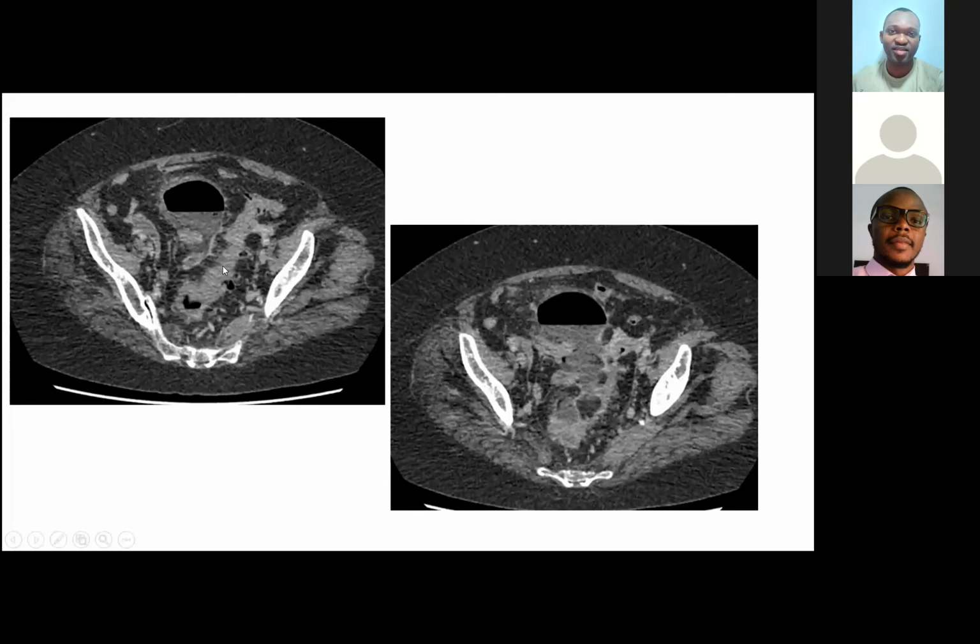So you've got to be careful that you don't put too much faith in what's reported as a normal X-ray of abdomen. There's a lot of pathology you can miss on an apparently normal X-ray, from inflammatory pathology such as abscesses and neoplastic tumors, to vascular ruptured aneurysms. All that can be missed on what is reported as a normal X-ray. And so if your patient is unwell and presented acutely, you've got to think seriously about performing the biggest hitter you have available. And in most instances, that means CT scan.